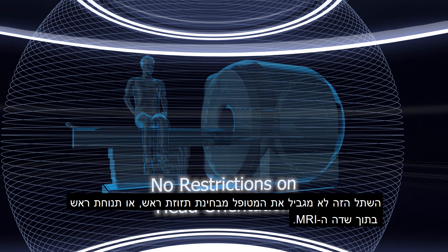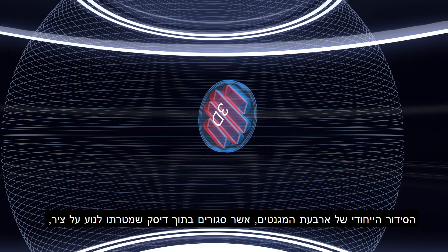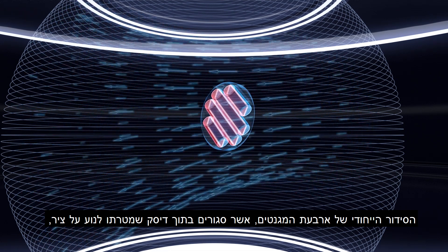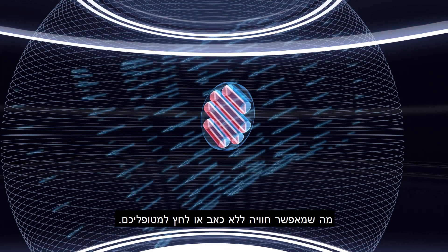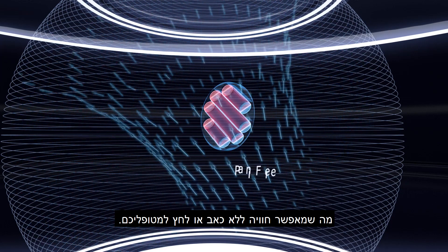This implant does not require any restrictions on head orientation or head movement in an MRI field. The unique magnet assembly is composed of 4 rotatable magnet rods encased in a revolving disc. This design provides magnetic field alignment in all three dimensions, ensuring low torque and a pain-free MRI experience for your patients.